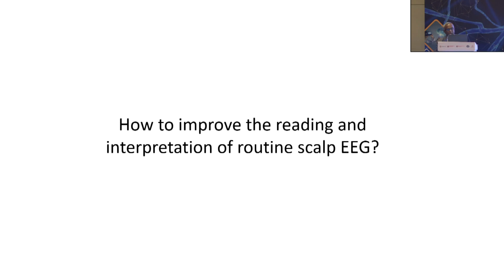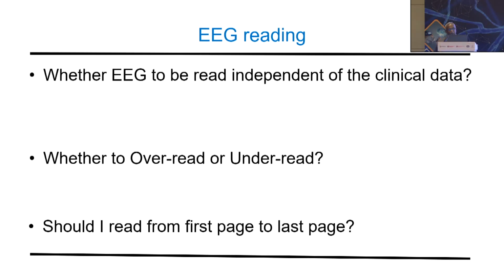How to improve the reading and interpretation of the routine scalp EEG. Let us try to answer a few of the questions you would like to ask yourself, whether EEG is to be read independent of the clinical data or not. All over the world, there is considerable controversy whether you should be provided with all the information before you read the EEG.